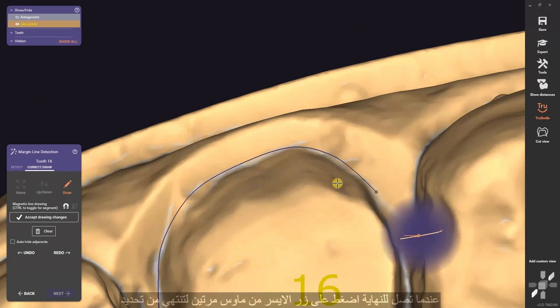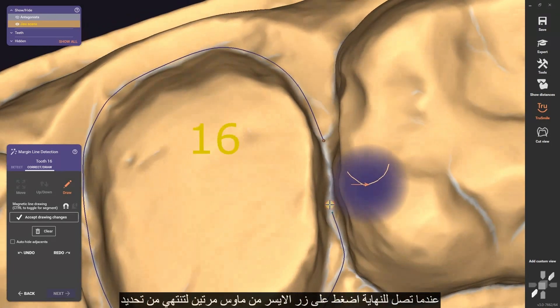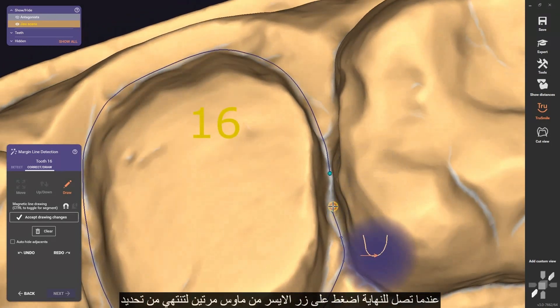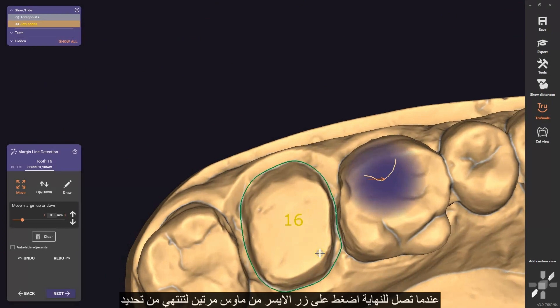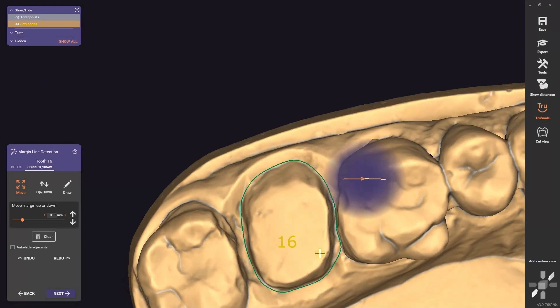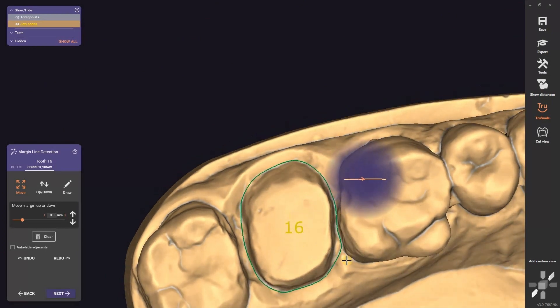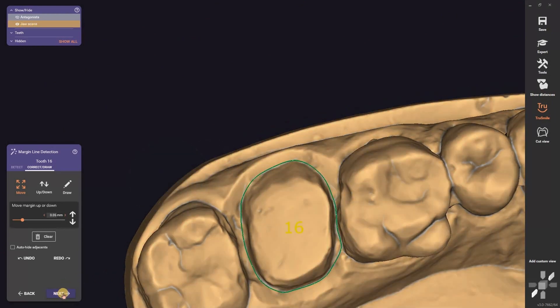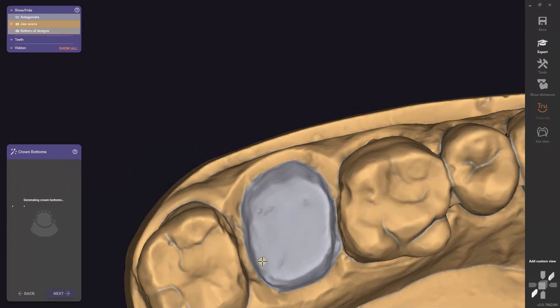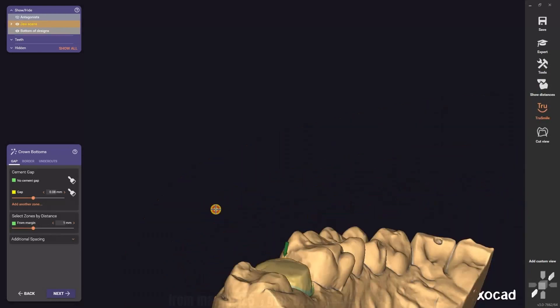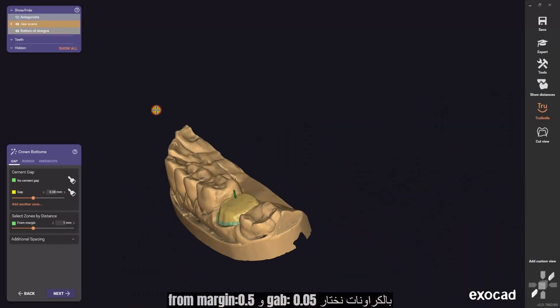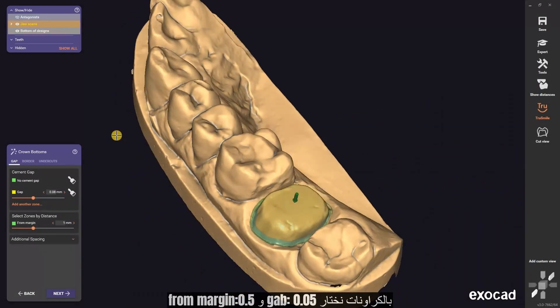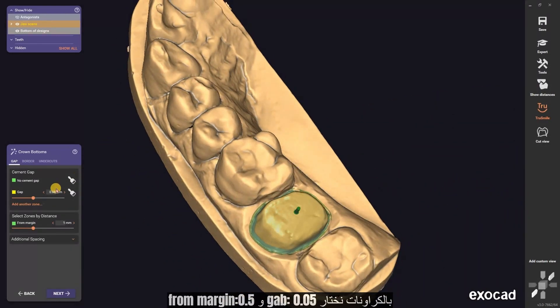When you arrive at the end, press the left click double time to finish detecting. Now we are on the crown bottoms part.